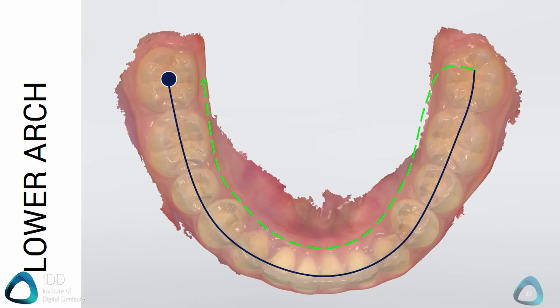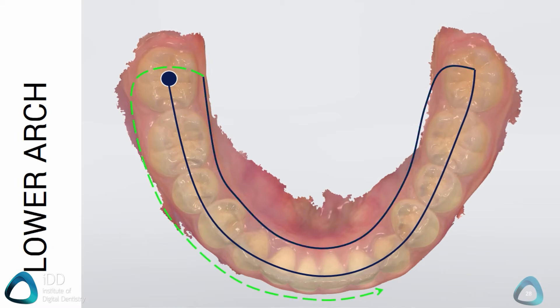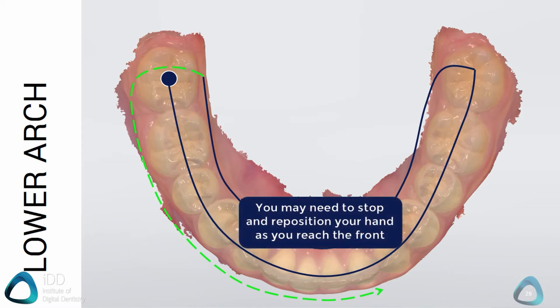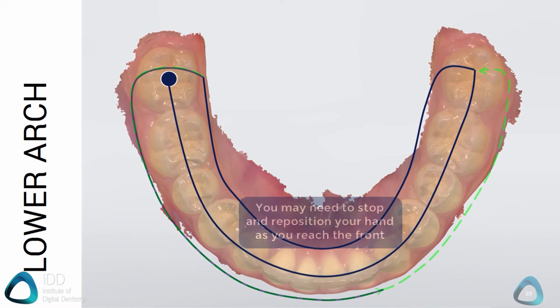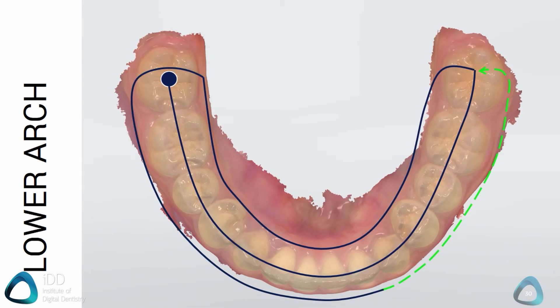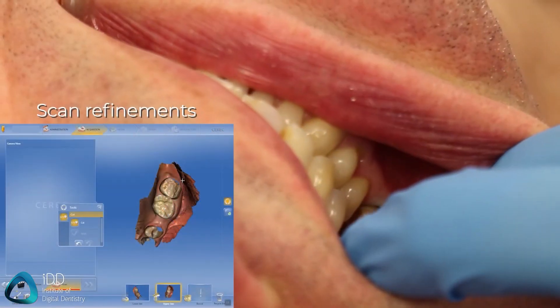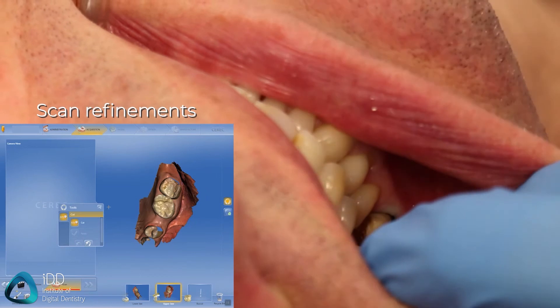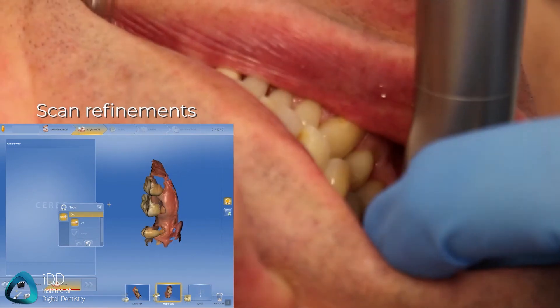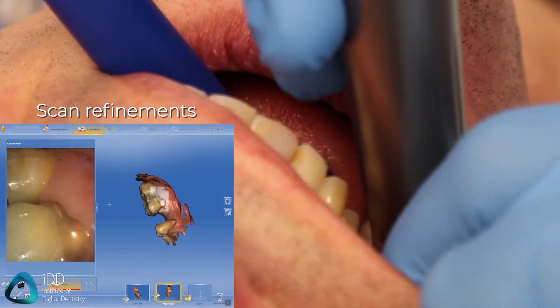Once you reach the opposing molar, tilt the scanner to the lingual aspect and move in a smooth motion to the opposite side. Cross the occlusal surfaces and take a scan of the buccal surfaces, ensuring you scan two to three millimeters of the buccal gingiva, as this becomes important for the bite registration. You may need to reposition your hand at the anterior aspect. Complete the scan by capturing the last part of the buccal surfaces on the posterior aspect. Check for any areas of missing data and capture these spots — if an area hasn't scanned properly, you can remove that specific spot and re-scan it rather than starting over.